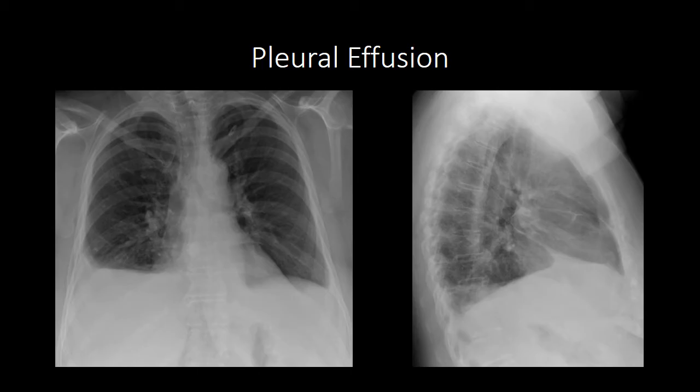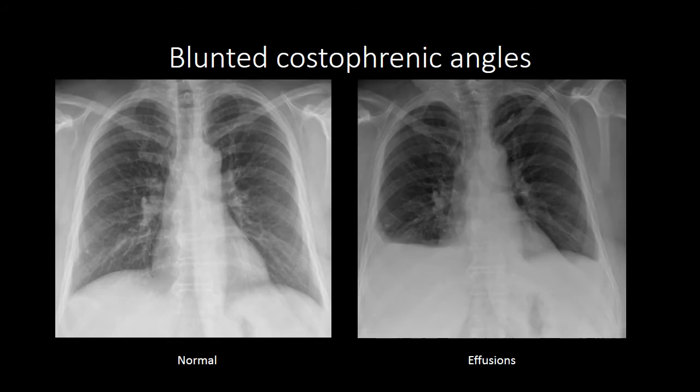If you look in the left hemithorax, we have likely a very small left pleural effusion, so you get a little blunting of the costophrenic angle, but it's not nearly as apparent as on the right. On the lateral radiograph, we see this blunted hemidiaphragm and a meniscal sign, with a little blunting or rounding of the costophrenic angle. Compare that to a normal patient, who should have sharp angular margins at the costophrenic angle — on both sides, we see a nice sharp costophrenic angle, whereas in the patient with effusions, we have these rounded or blunted costophrenic angles.